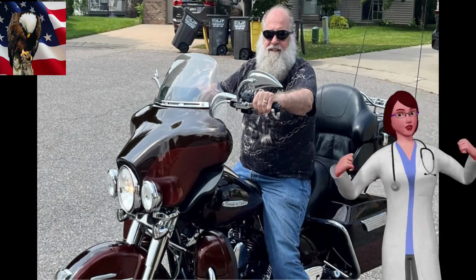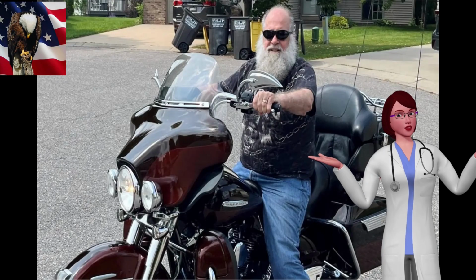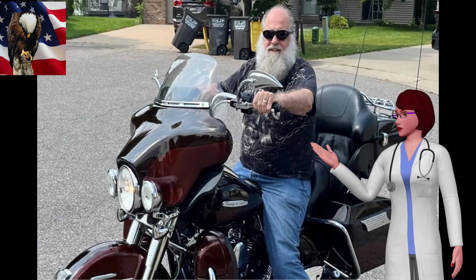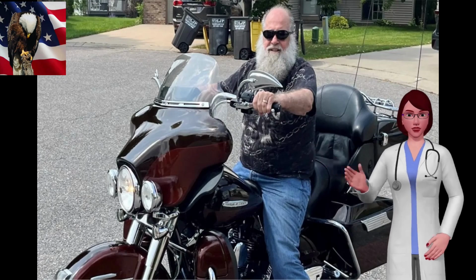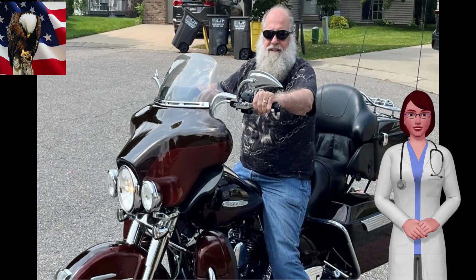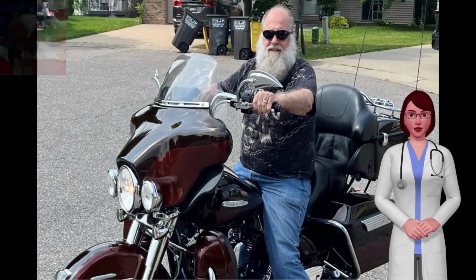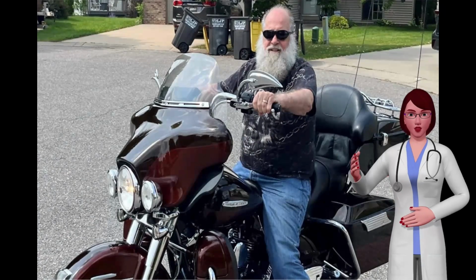The battery is guaranteed to last 10 years, although many will likely last longer, Dr. Ziegler says. When the battery dies, the knee replacement continues to function like a traditional knee replacement. Dr. Ziegler is quick to point out that patient privacy is always at the forefront. Real-time data is not collected, and there is no GPS component showing the care team where the patient is located at any time. Patients also can choose to stop uploading data if they no longer want their metrics shared with the care team.